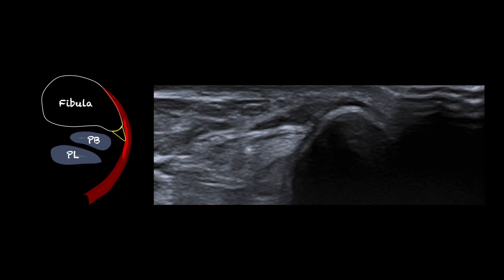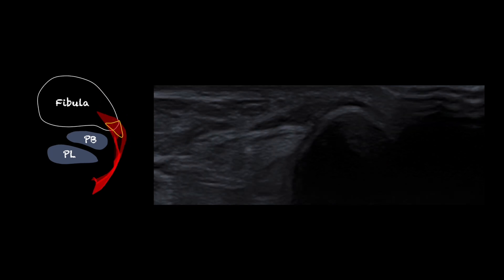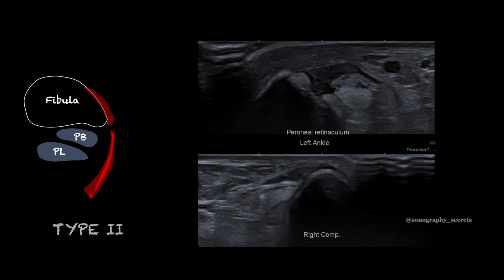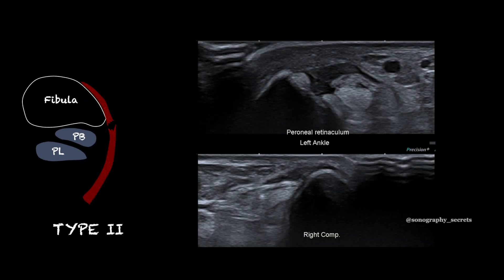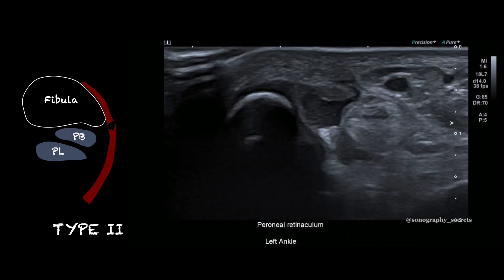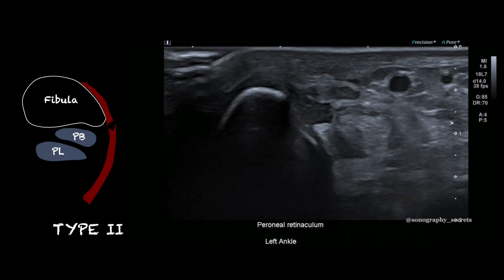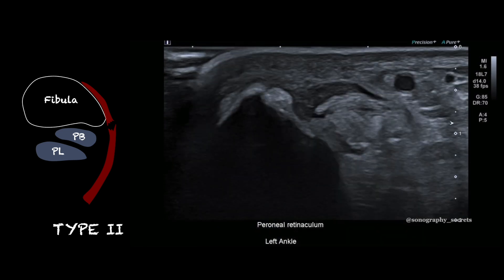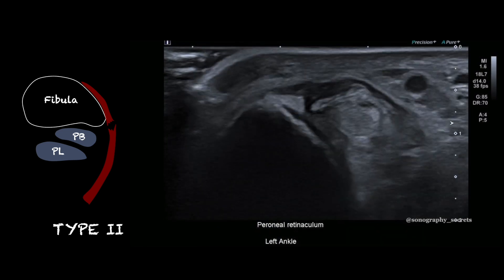Here again is the normal superior peroneal retinaculum at its fibular insertion. In this example we can see a tear of the superior peroneal retinaculum — a type 2 injury — and this was an isolated injury following a post-inversion event.